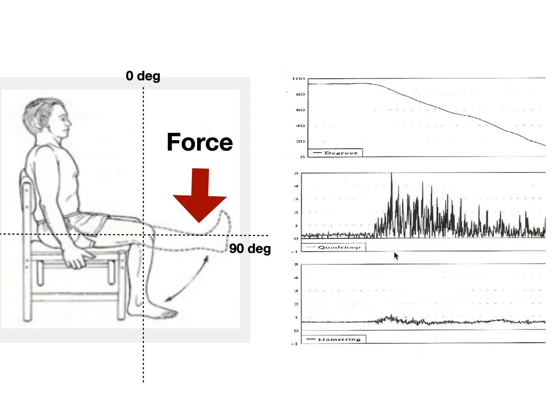You can see it's really different from baseline, right? The amplitude is higher and there's a lot of noise. So that's a raw signal. If we want to analyze it in a laboratory setting, we're going to do some post-processing. But by seeing the raw signal, we're able to identify if the muscle is activated. You can see the amplitude of quadricep is pretty high, right? And the amplitude for hamstring, compared to quadricep, is pretty small.